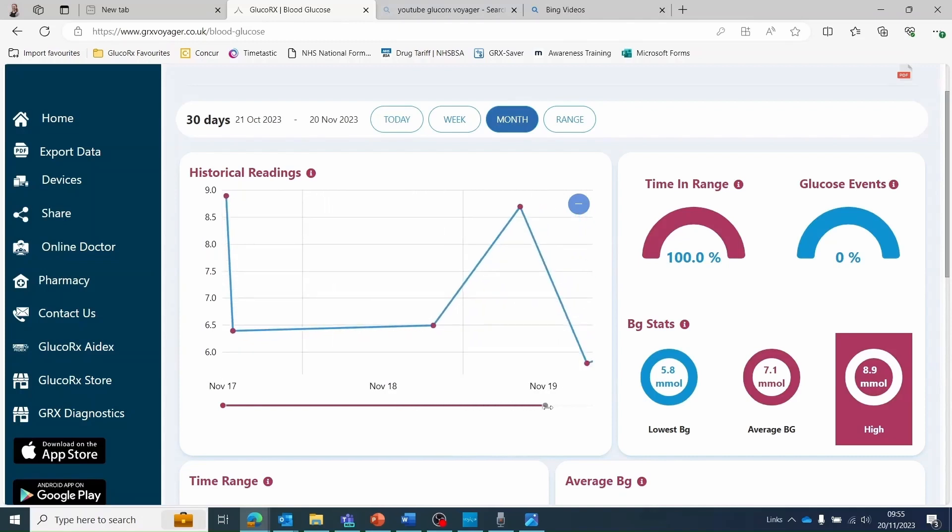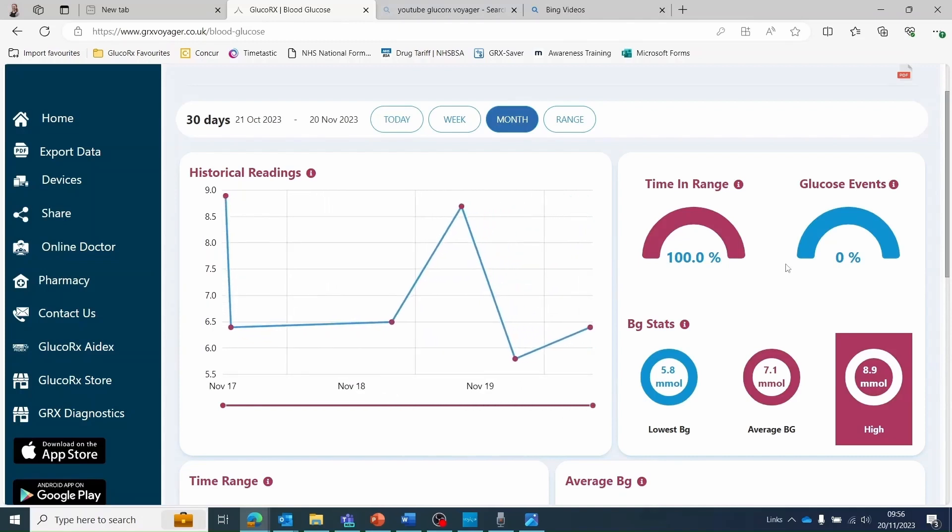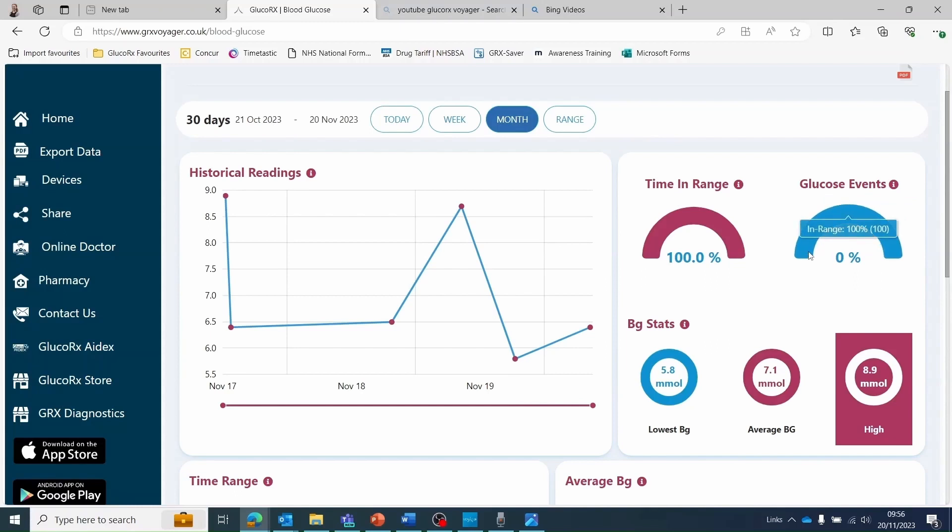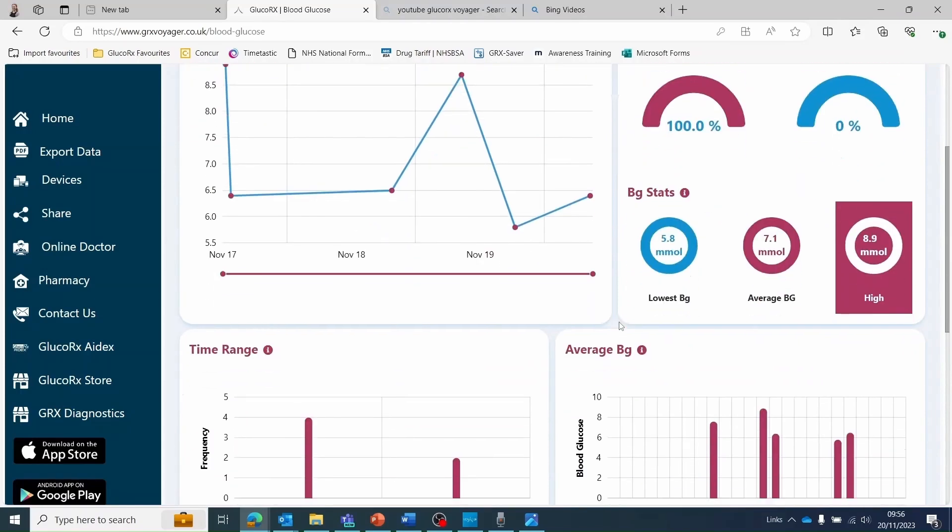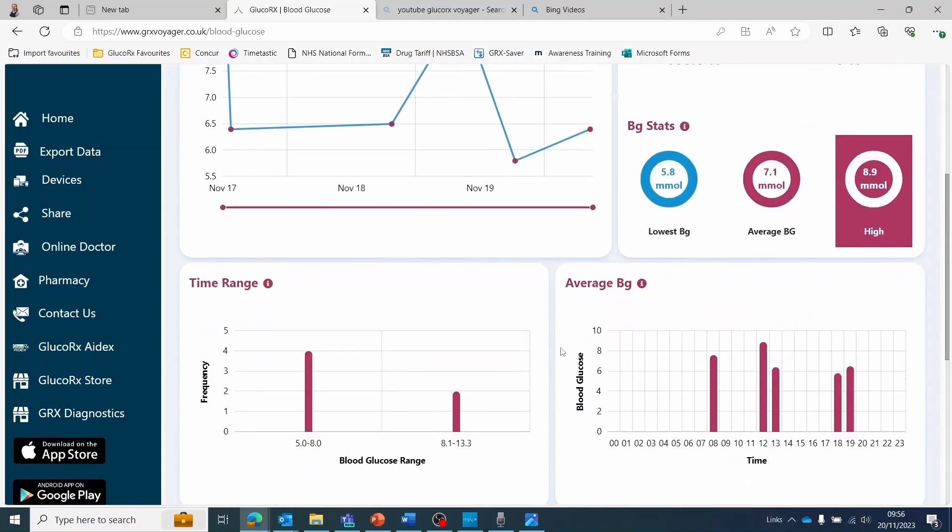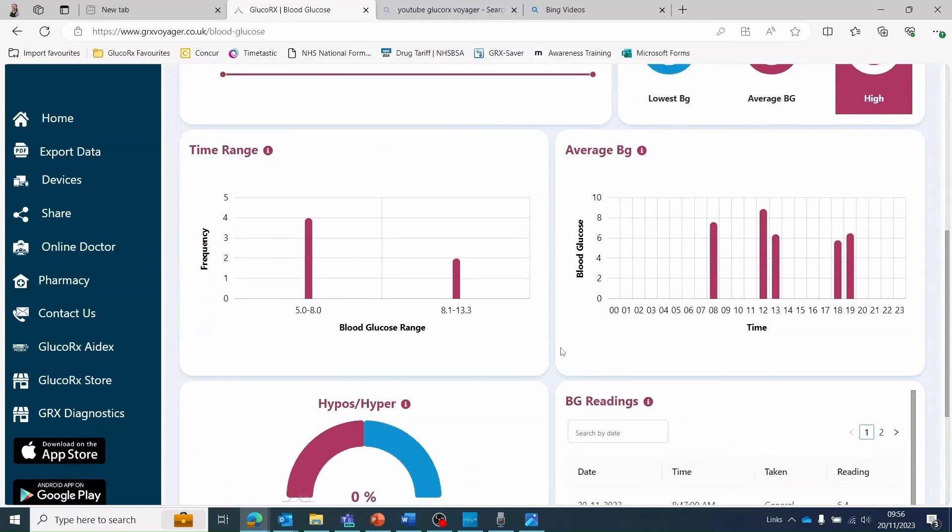There are some statistics available in the pie charts, for example how long you have spent within your target ranges and what your average blood glucose level is for the date range selected at the beginning. This information is also detailed below in the two graphs.